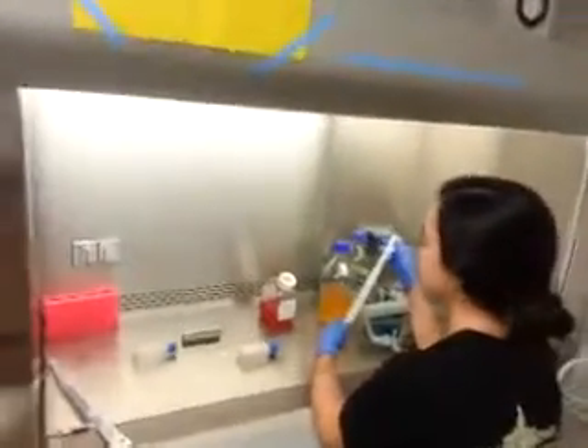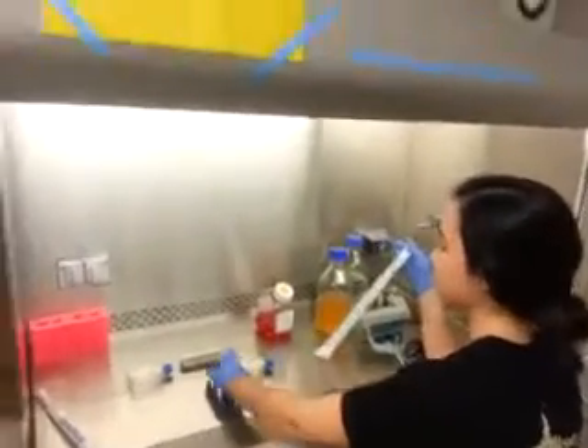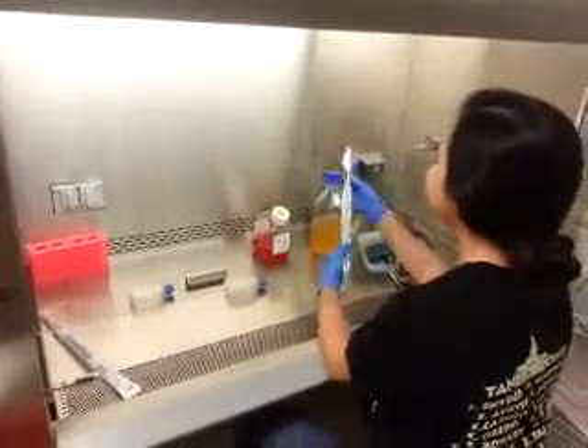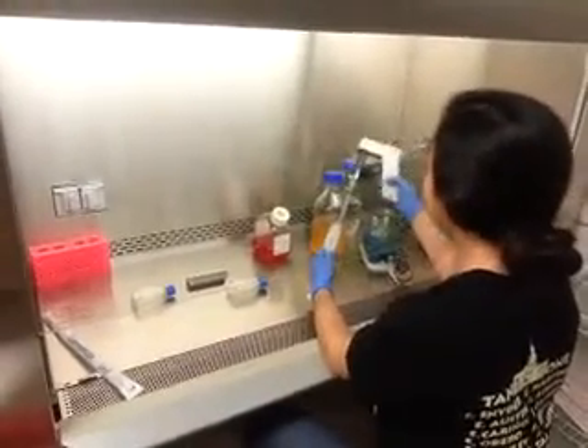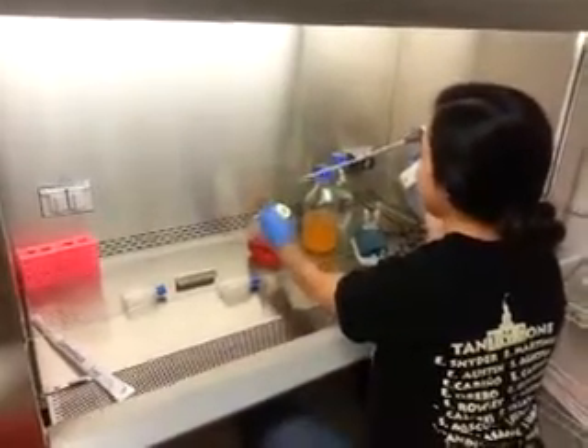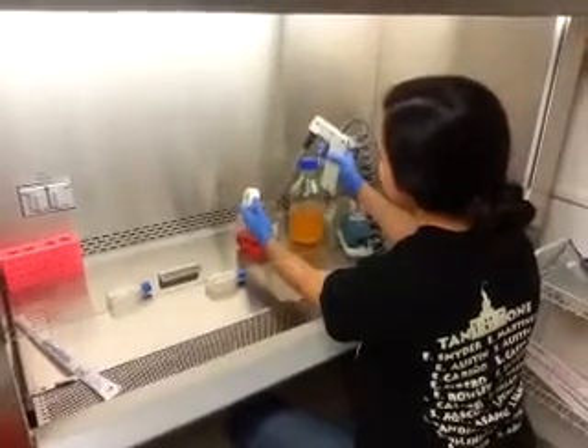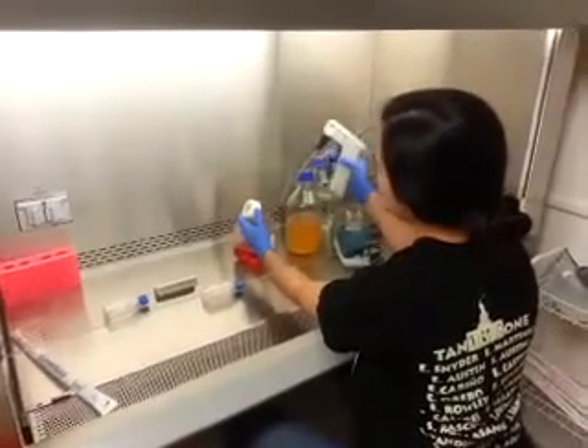You got it out of the incubator already. Now you're going to add half a mil or five mils of that stuff, then move over half a mil of that, and then put another four and a half or five mils out of there.